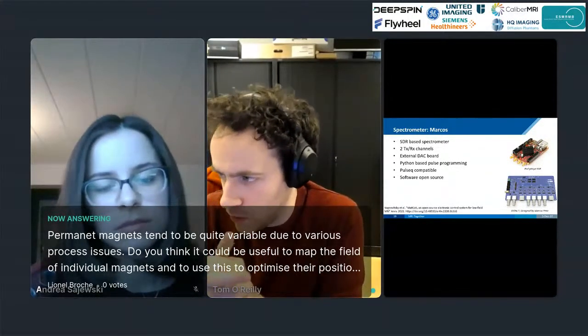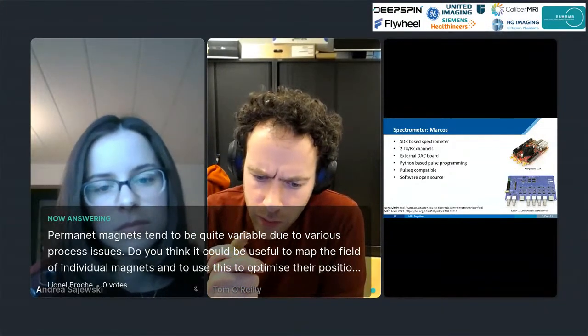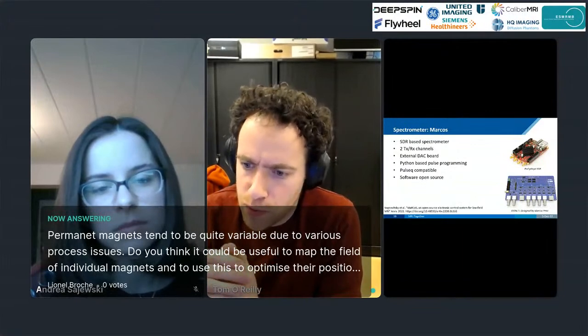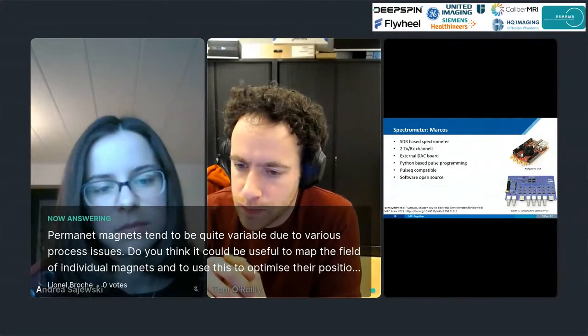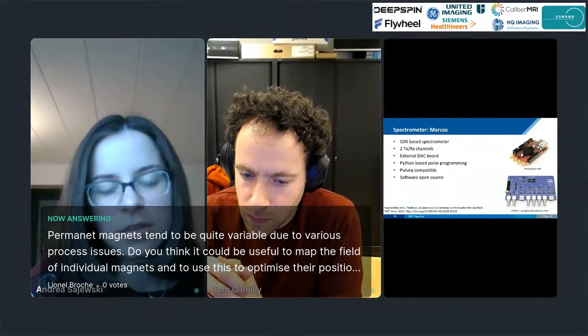And then other than that, you can just shim it out, especially the inhomogeneity caused by magnets of varying strength. That's quite a low order perturbation on the magnetic field, and that's quite easy to shim out using shim magnets. Can you typically get the quantity that you need from one batch?